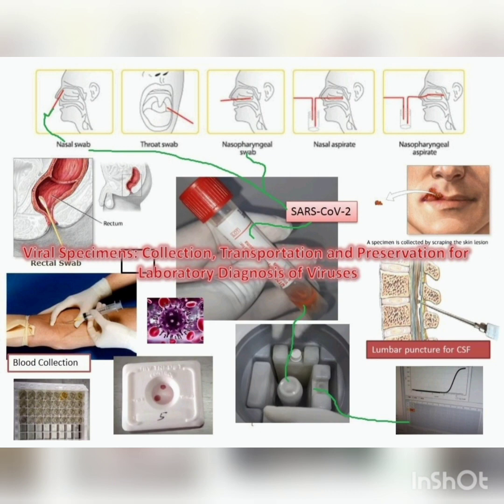Because once coronavirus enters through the mouth and nose, it will form colonization in the throat. So if you collect the swab from the throat, you will find that virus. That's how, where the organism is found, from that site you need to collect the specimen for study. If it is a non-healing wound and you want to detect the organism causing the pus, you need to collect the pus from the wound.